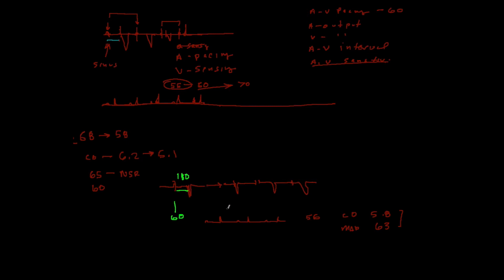But the key thing here is that probably there's something about the patient's own native conduction that's a little bit better. And that's actually a pretty common scenario, especially when you have a hypertrophic ventricle. Rather than having a pacing impulse spread through muscular tissue, you have anterograde AV conduction, where the impulse is going down a neural network, and you have a very coordinated contraction of the ventricle. It's quite orchestrated. It starts in the apex and has this screw motion upward, so you actually get a better stroke volume. So the question is, where do you go back to if you want to try to make things better with pacing?